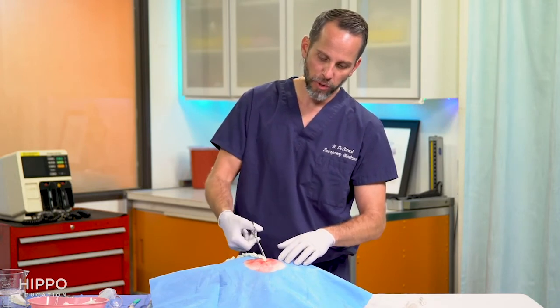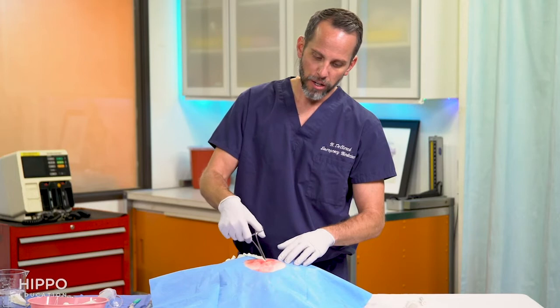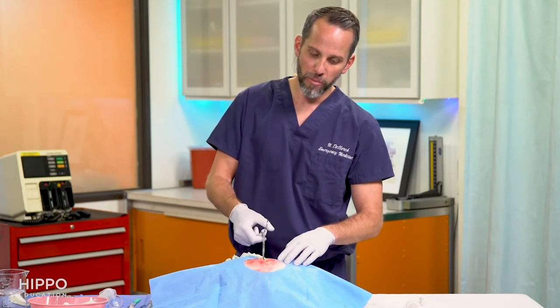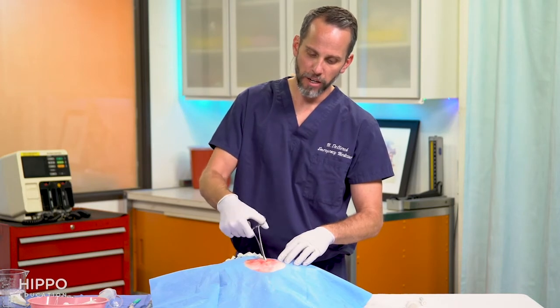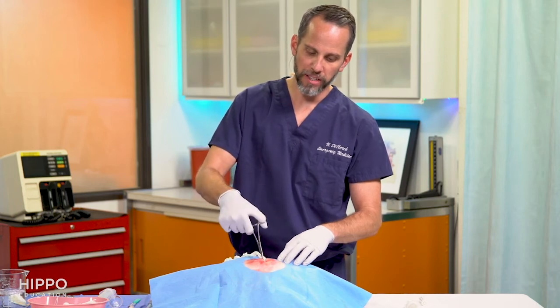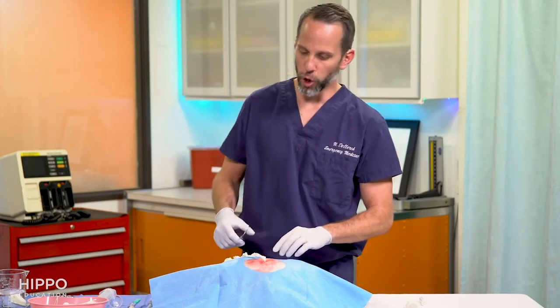As you pack this, you just want to go in all the directions of the abscess. You do not need to overpack. This is a loose packing. Overpacking just creates pain and more distension. But you want to make sure you don't have any gaping, big spaces that still are open.